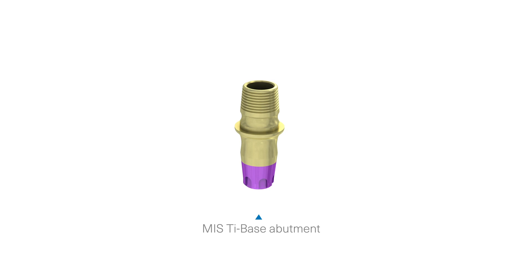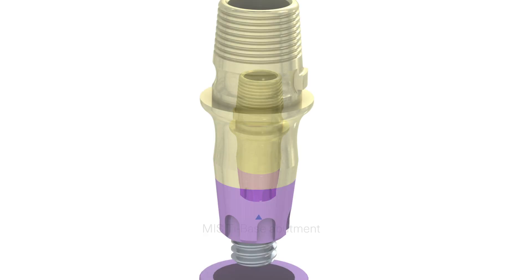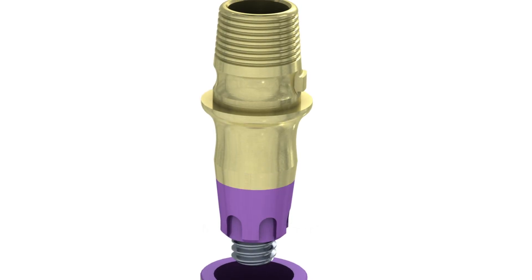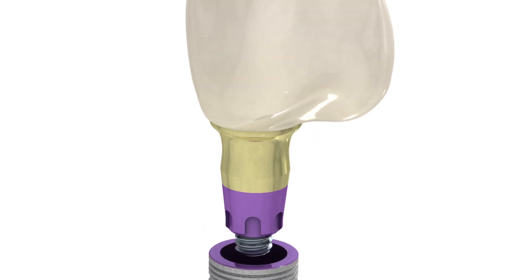In this video, we'll show you how to use MIS tie base in a single-tooth, screw-retained restoration. For this procedure, we use a conical connection implant.